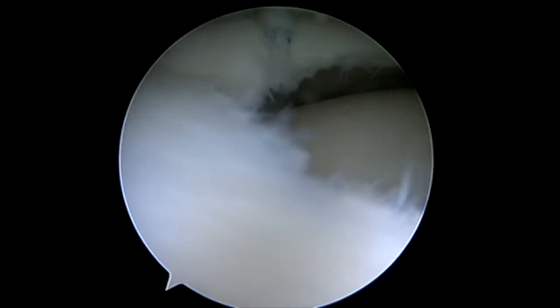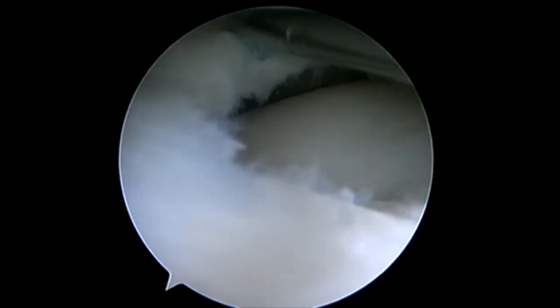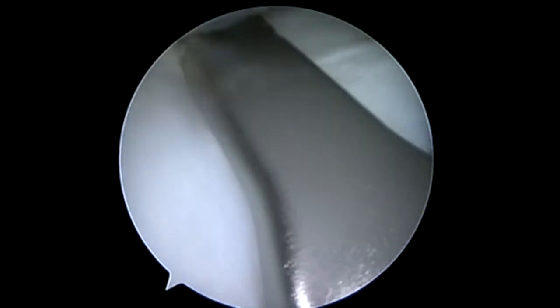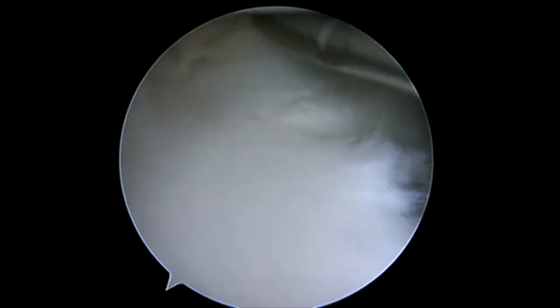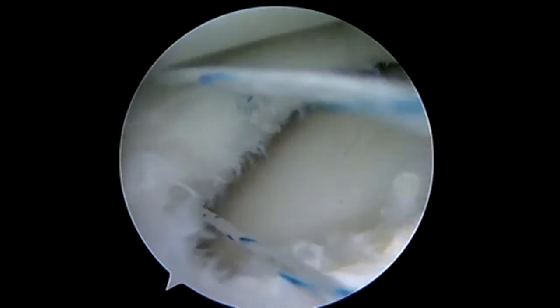As we continue our repair more anteriorly, with our far medial portal we're able to gain a greater bit of access. We're going to extend our lower jaw. You can angle the device — you just want to make sure that you don't angle so far that you might miss the jaws. Deploying suture around the meniscus and in the upper jaw, we're grasping a good portion of the capsule.